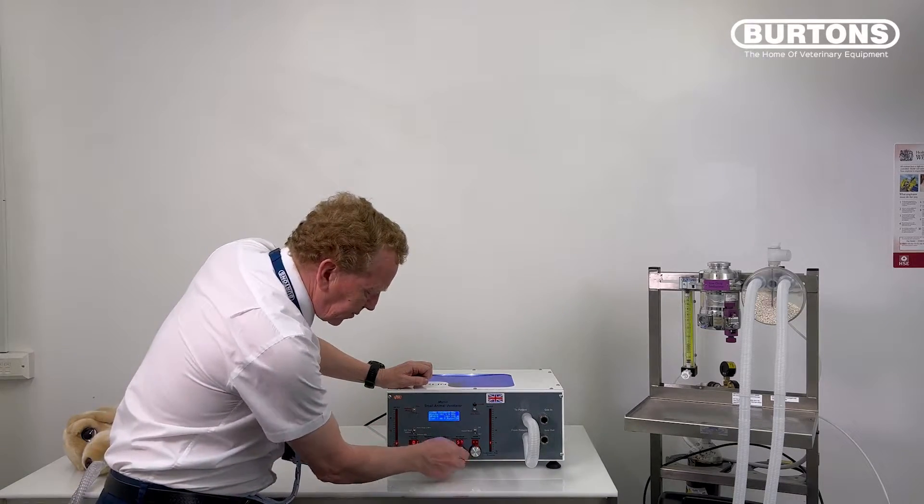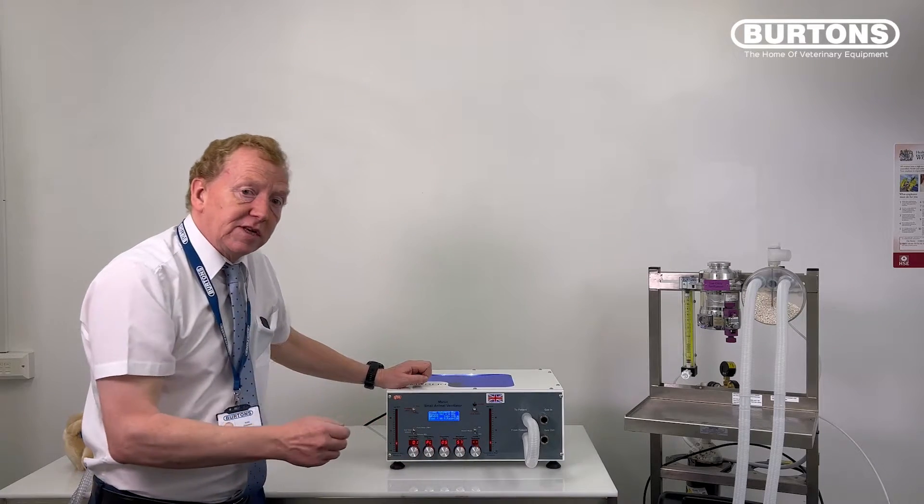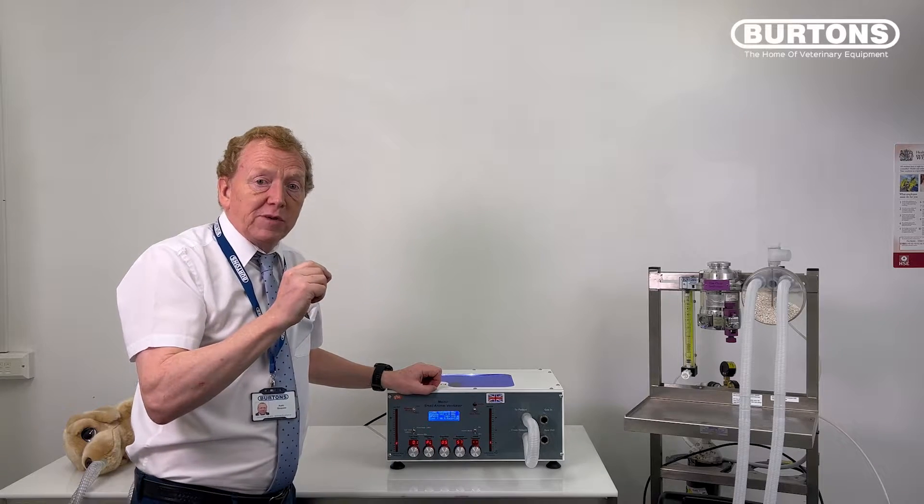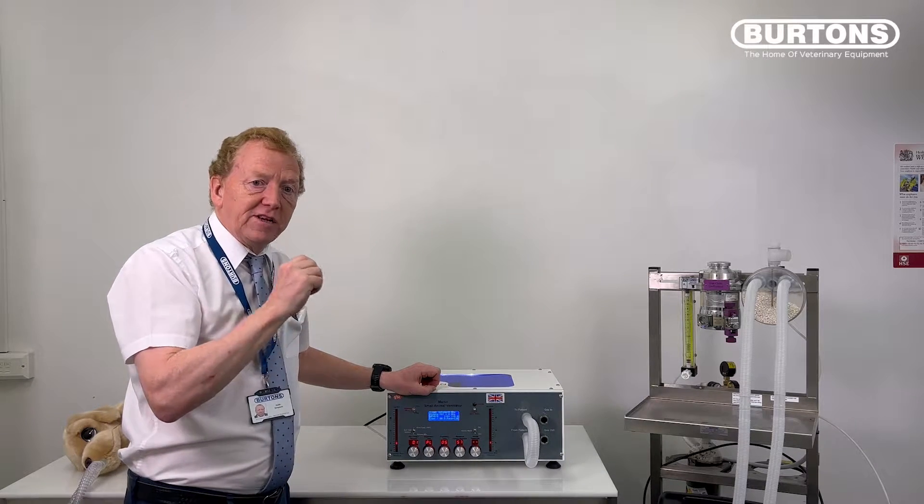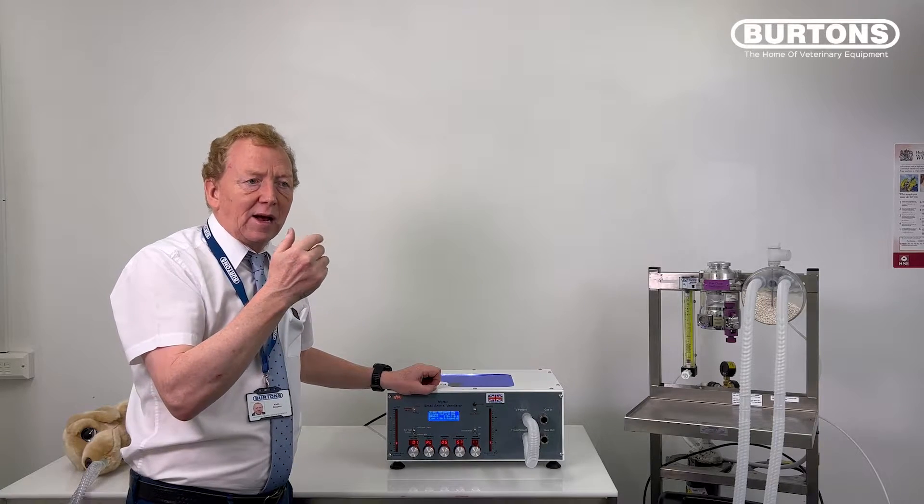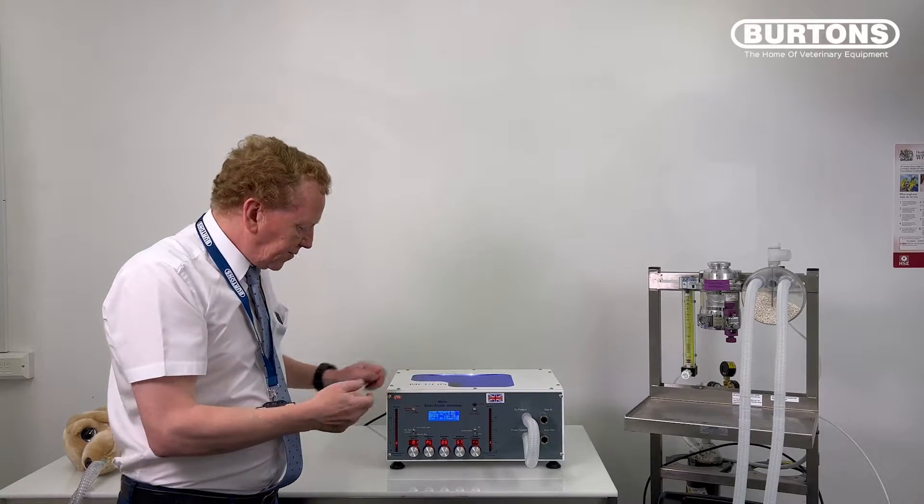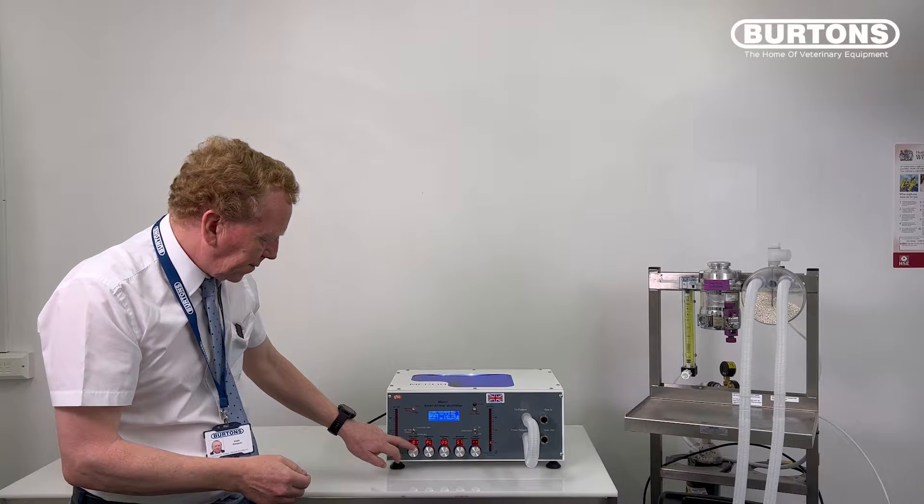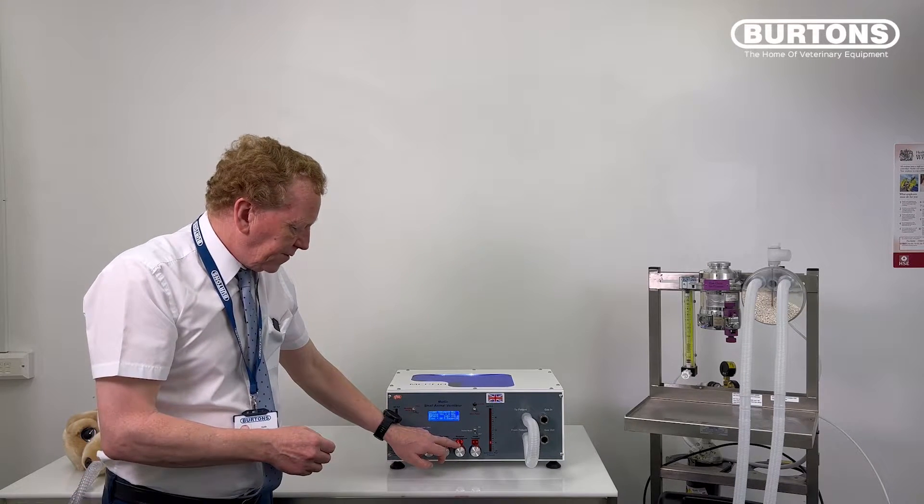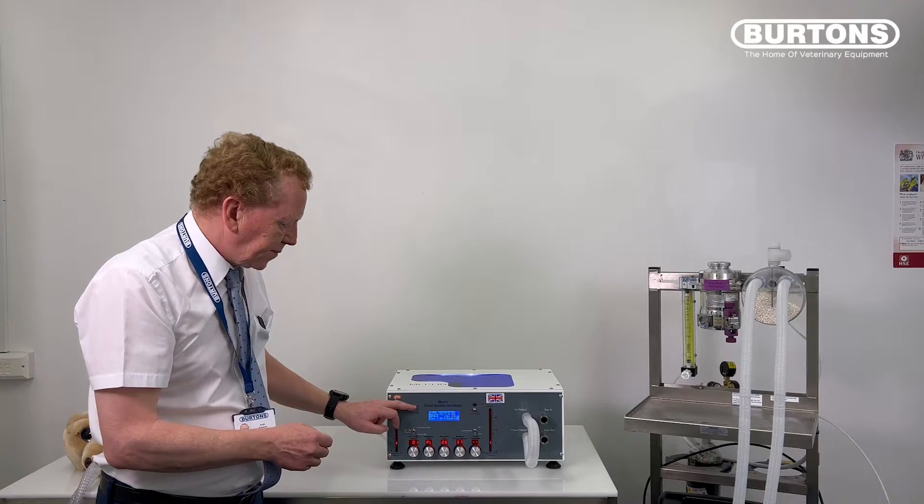We're going to set our maximum pressure now to 57 centimeters of water. So we're putting in just over one mil per second into a blind tube and see if we can get up to 57 centimeters of pressure. If we can, then we've got absolutely no leak whatsoever. It's very simple: set it up 0.1 PL, doesn't matter about the expiratory time, 57 on the maximum pressure, and hit go.